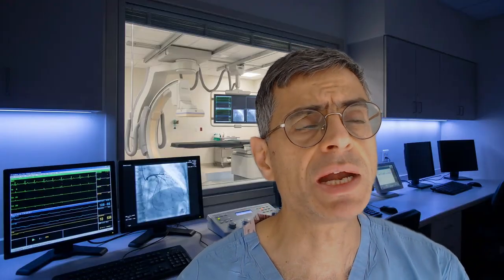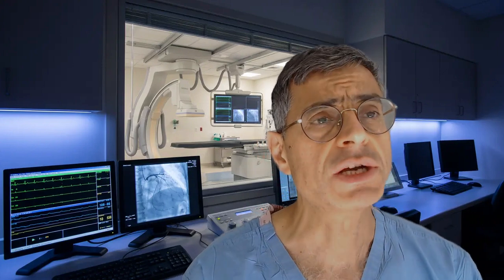But also CT can provide input on physiology with FFR-CT and other modalities, and one can get an assessment about the pressure drops across the coronary tree. Do we have, as you mentioned, disease that is mainly focal and as a result more likely to respond well to stenting, or more diffuse disease, in which the efficacy of the outcome, the ability to improve the physiology, and as a result, the patient's symptoms and the clinical outcomes may not be quite as good as we think.